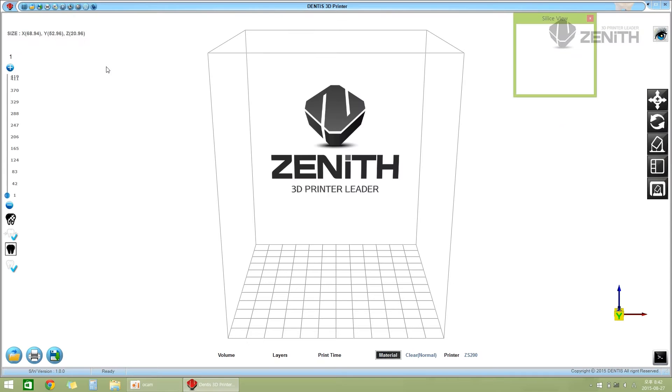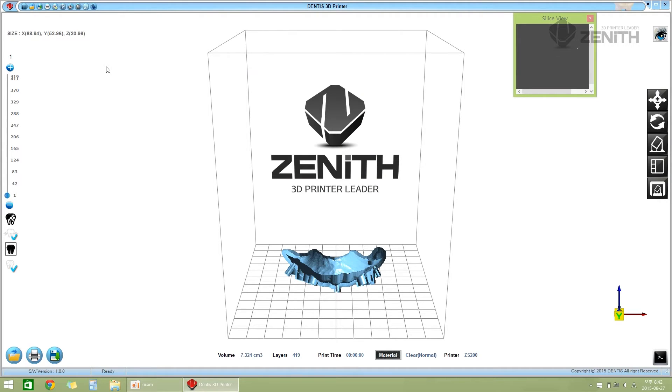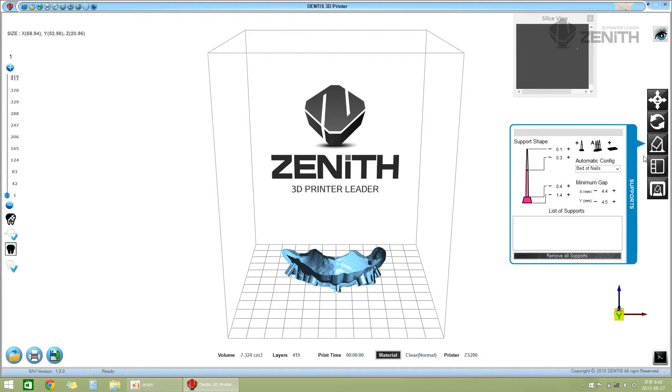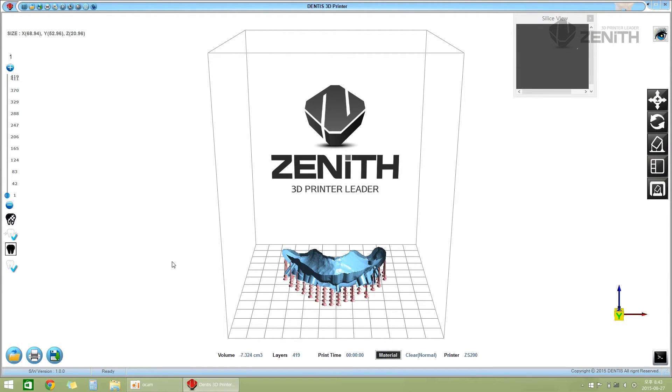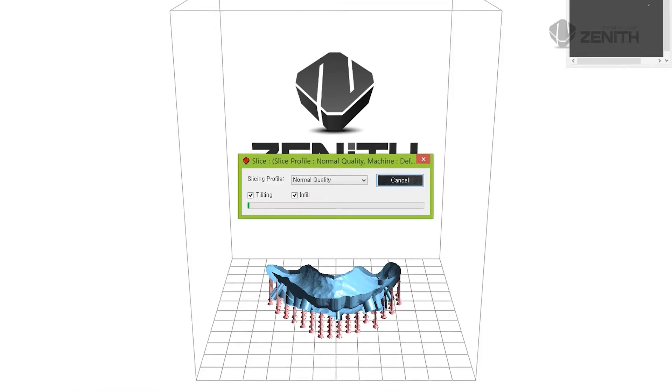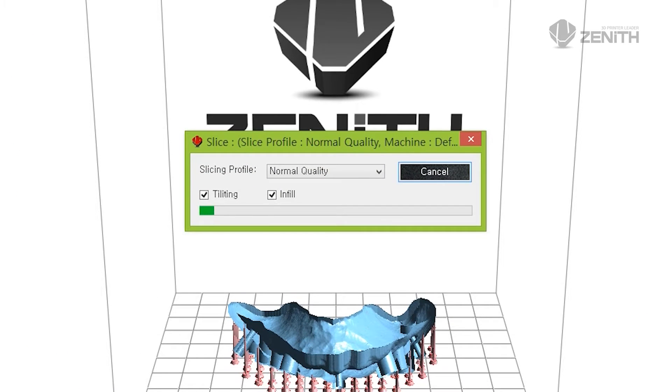The 3D shape of the STL file you selected is displayed on the main screen. Select the support menu on the right side to set up support. If you push the printer button, data is downloaded and the printer will run automatically.